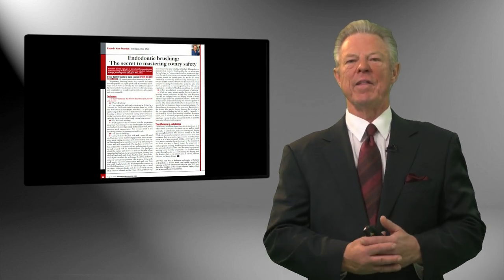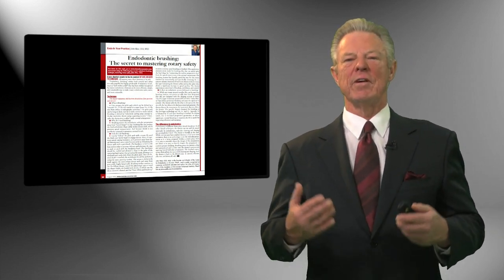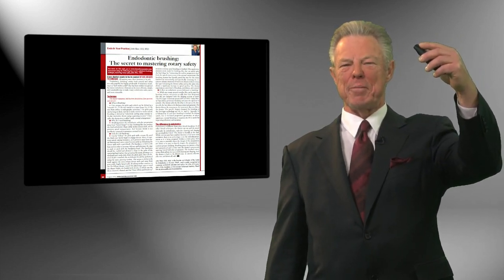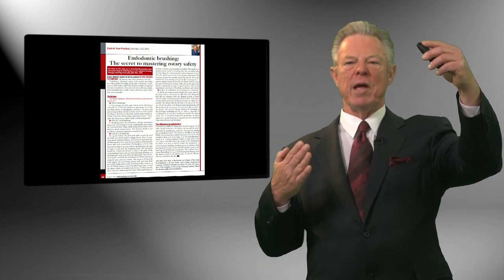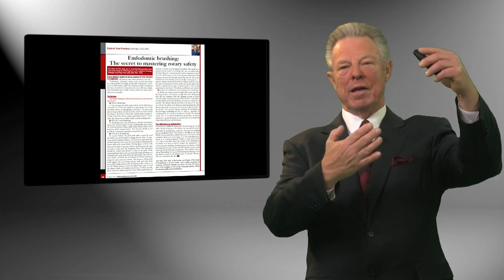And this article behind me explains it, but let me show you now. And I even suggest you in the audience replicate what I'm doing. So let's put your left hand up if you're right-handed, and your right hand up if you're left-handed. And you have a rubber stop on your rotary instrument, and you're going to let it run, and I'll show you how I hold the handpiece shortly.